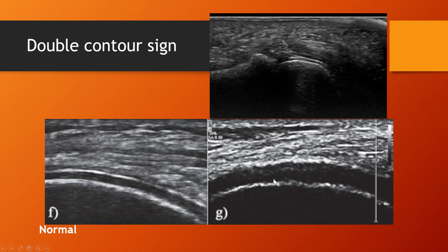So comparison images would be essential. And here's a case where we're looking at the plantar plate in a sagittal view ultrasound from a plantar approach. The proximal phalanx and metatarsal are seen here. And the hyaline cartilage has this very thick echogenic rim here, and that may be deposits of MSU crystals. So it seems to enhance that superficial margin of the hyaline cartilage.